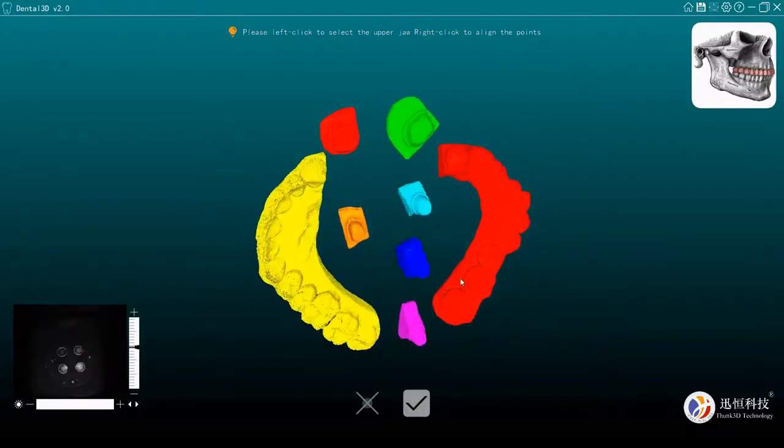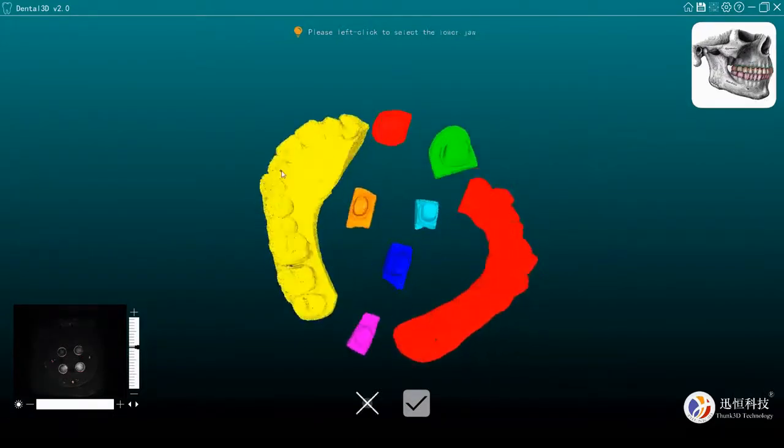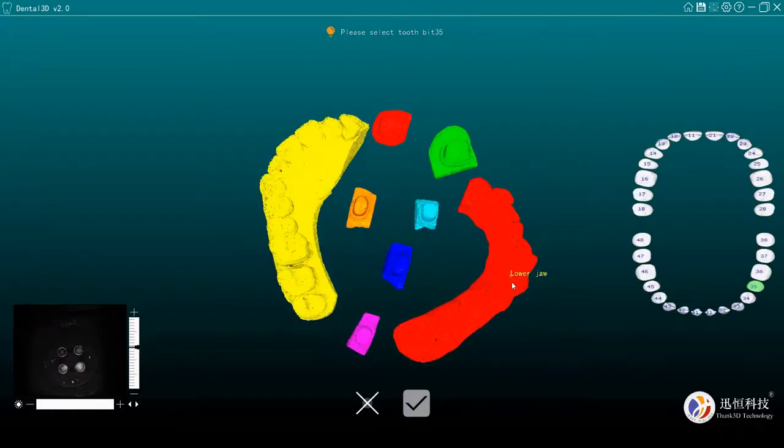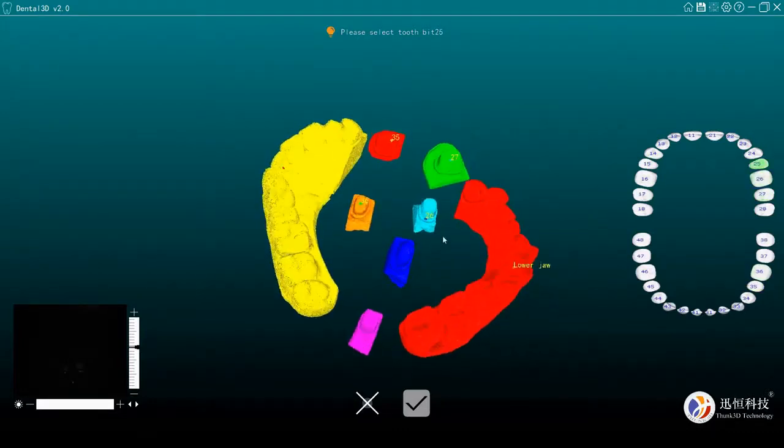However, in this step, if you fail to recognize which is which, just try to make sure as right as possible. Because if we fail aligning later, we could manually align as a remedial action.